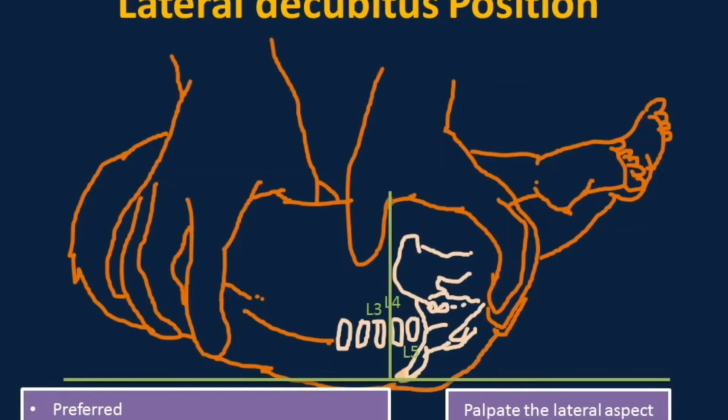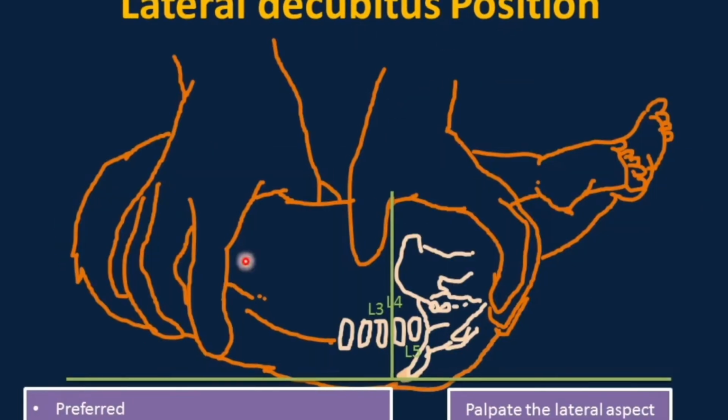the procedure. The lateral decubitus position is easier and is the preferred position to obtain CSF. It is easier to align the back along the table to be parallel, so this will decrease the chance of an unsuccessful procedure, and also there is less incidence of post-puncture headache. And this is the procedure where you will be able to measure the opening pressure.